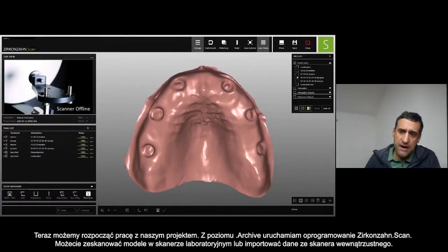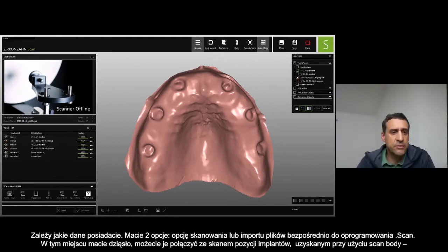After you create your project in the archive, you can open the scanner. You can scan directly from the scanner if you have the model, or you can import the data if you have intraoral data — depending on the case, you have both options: scanning directly or importing the files into the scan software.